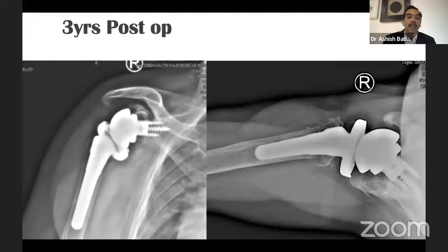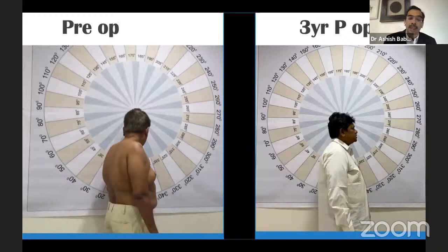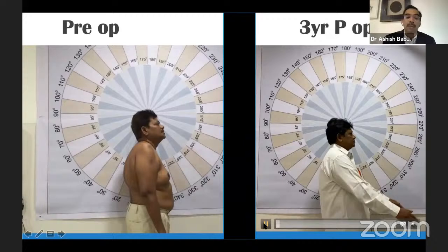This is another patient. This is a neglected posterior dislocation. The surgeon didn't pick it up, and this is what has happened. The head of the humerus is behind the glenoid. And this is his result. We've had to do, again, a reverse in a 51-year-old, but this is the lasting solution for him. But these are difficult cases.